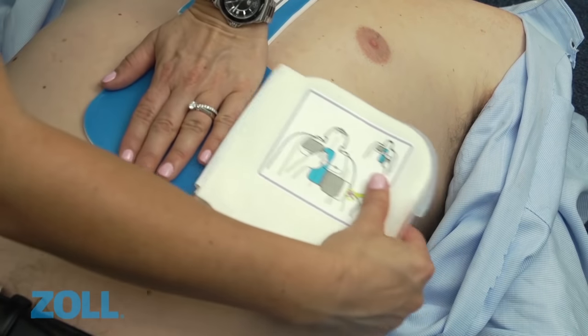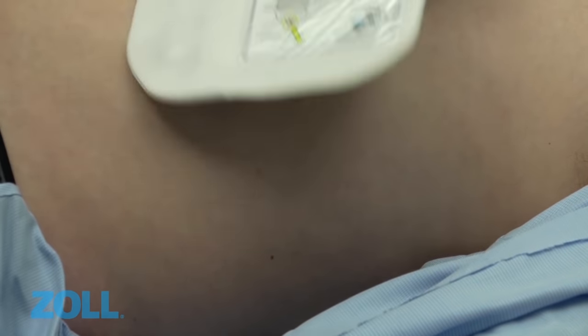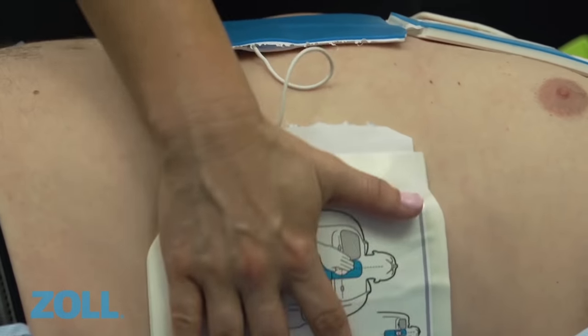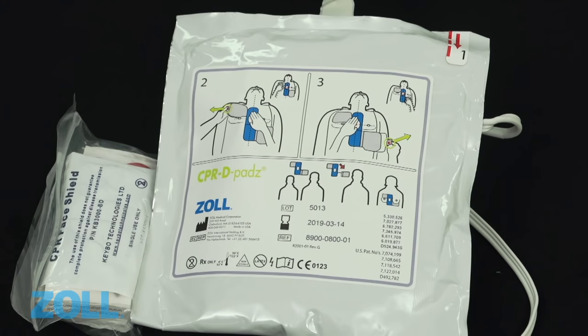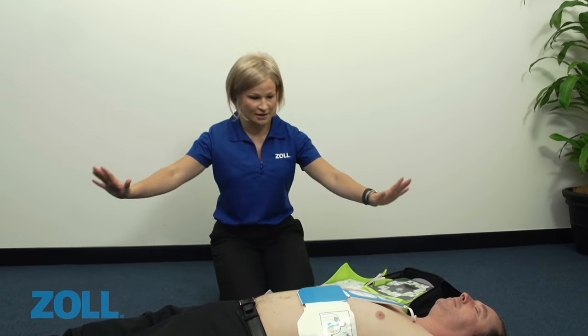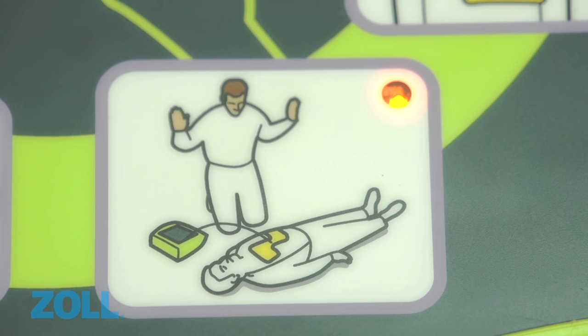If the patient is large, you will need to tear away the lower pad at the perforated line and extend it before pulling the number 3 tab. Instructions on the electrode pack remind you how to attach the electrodes to the victim. Once the pads are applied, the AED Plus will automatically analyze the victim's heart rhythm.